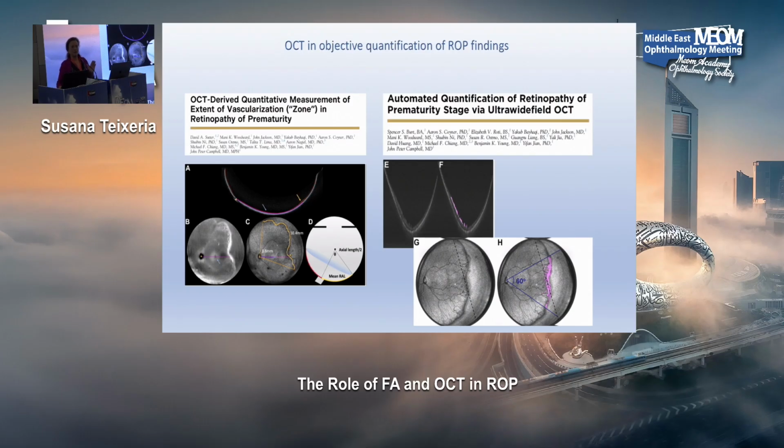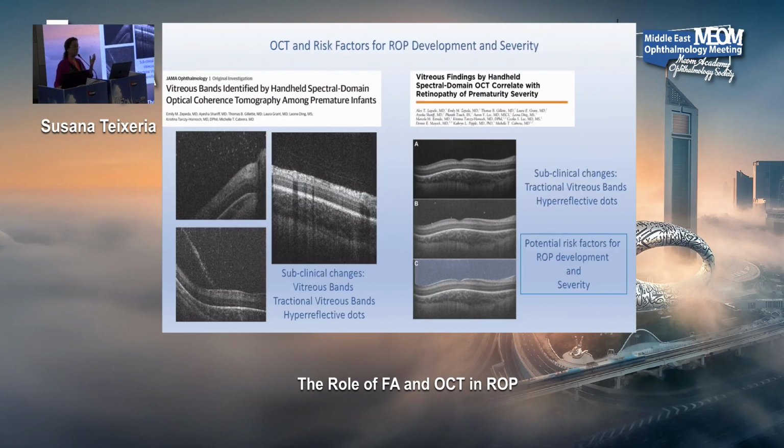So with, again, the artificial intelligence, we can objectively measure and compare all the stages and decide when we have to perform the treatment or not. So objectively, OCT is trying to be used in this kind of algorithm to decide if you have to treat or not treat these eyes. Of course, you have to have this machine, and this machine is quite expensive from my knowledge.